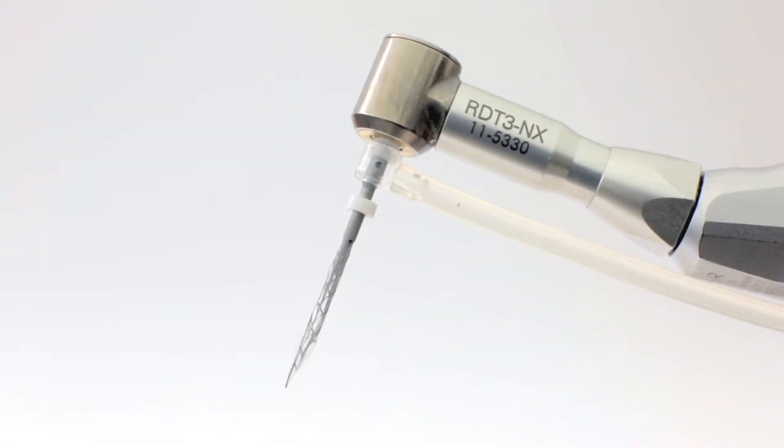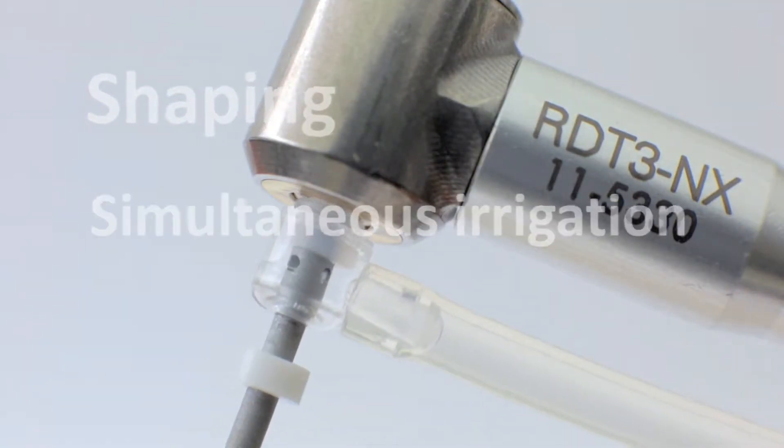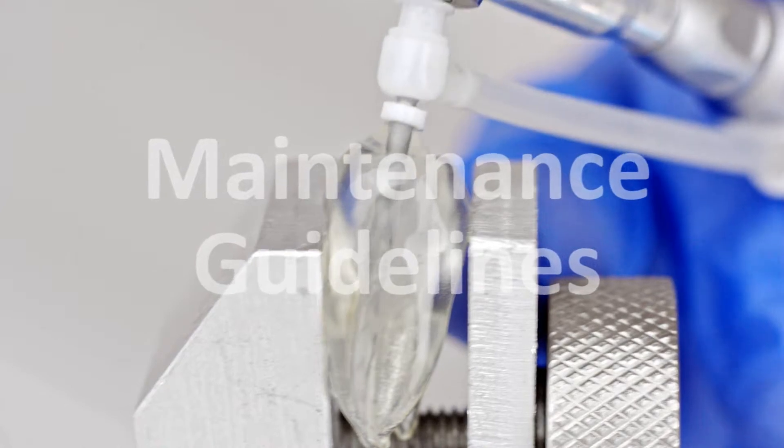The SAF system, as the first endodontic system to integrate shaping of the root canal complex with simultaneous irrigation and agitation, requires proper maintenance to attain good function. The following guidelines will help you to achieve this task.